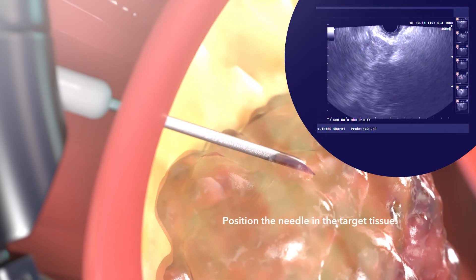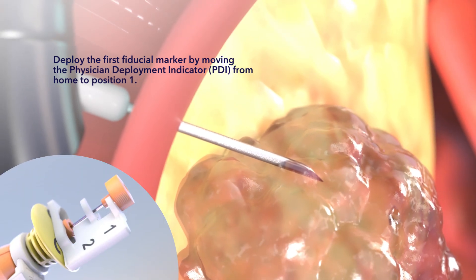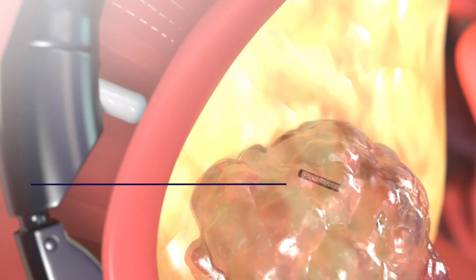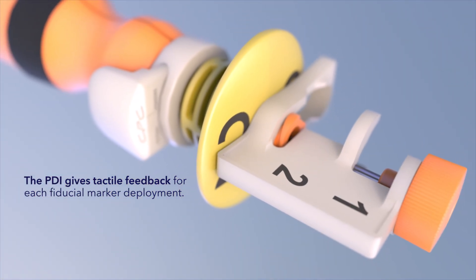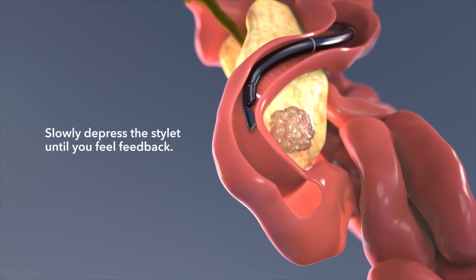Position the needle in the target tissue. Deploy the first fiducial marker by moving the physician deployment indicator from home to position 1. The PDI gives tactile feedback for each fiducial marker deployment. Slowly depress the stylet until you feel feedback.